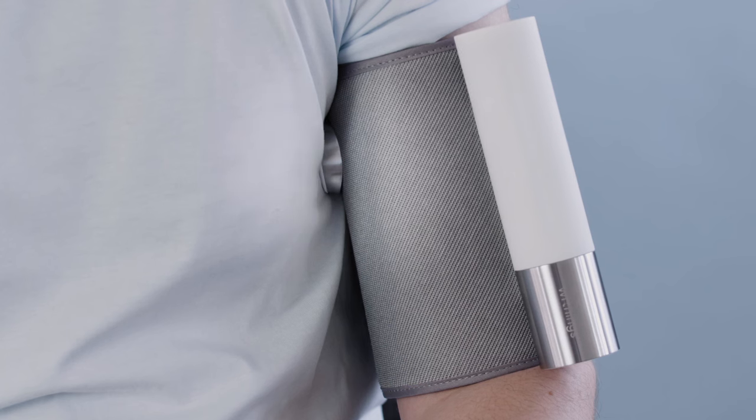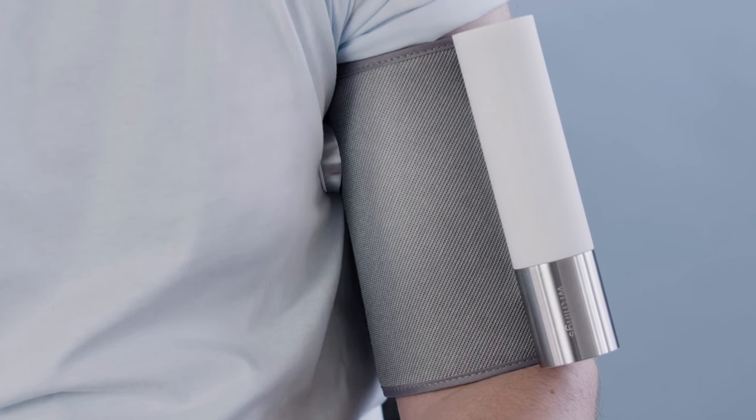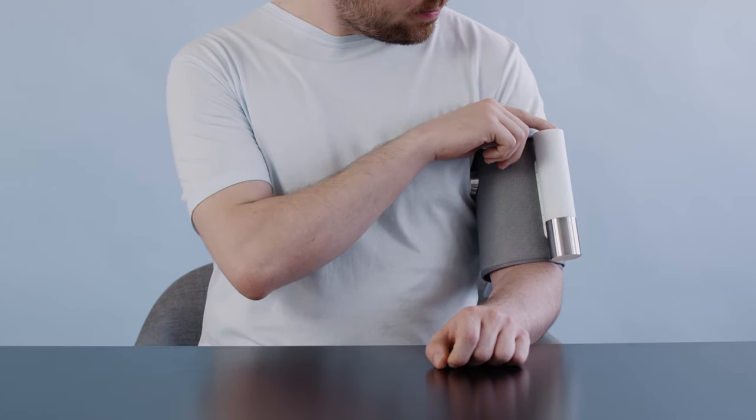The stethoscope should be placed so the flat surface is in contact with your chest. To take your blood pressure, place your arm on a table and keep it level with your heart. Push the button once to turn it on and once more to start the measurement.